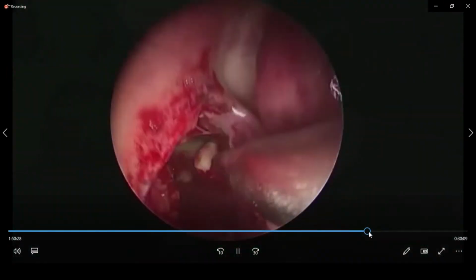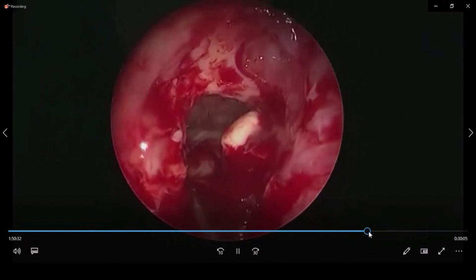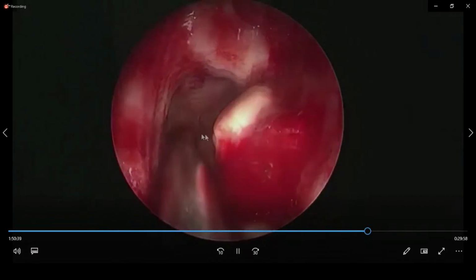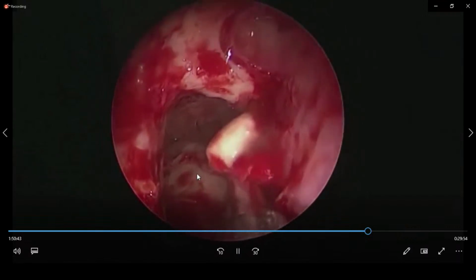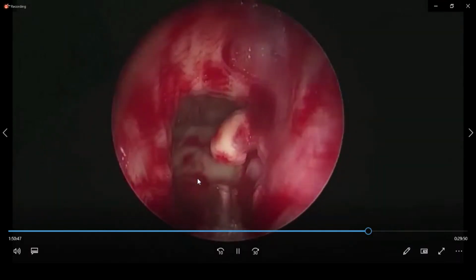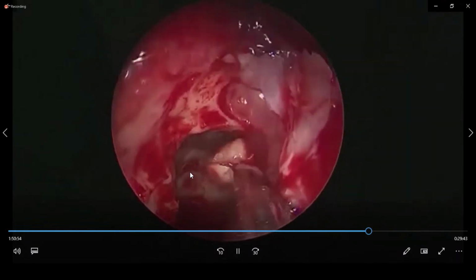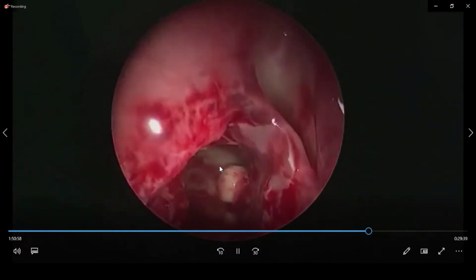See now, the big frontal sinus drainage pathway. Now see, this is the frontal sinus, this is the party wall between this supraorbital recess and this party wall being more and more removed to widen this axis, and this is the osteoma which is getting dislodged. And see finally how the frontal sinus outflow is getting bigger and bigger.